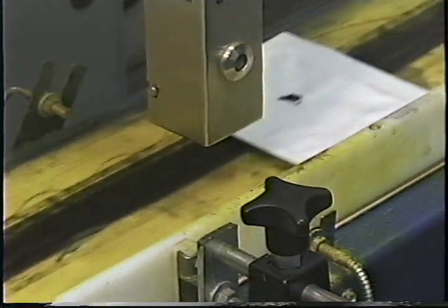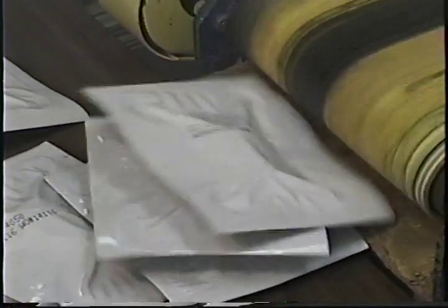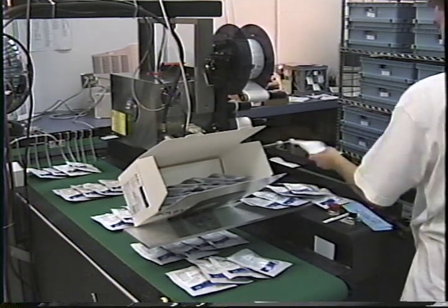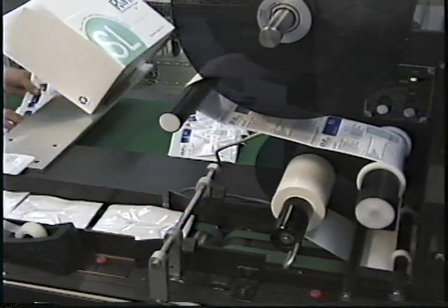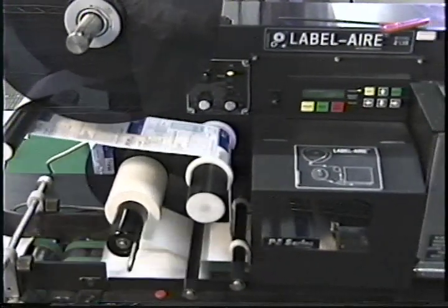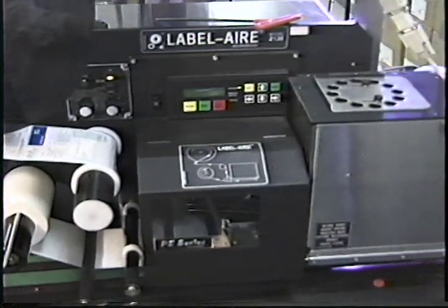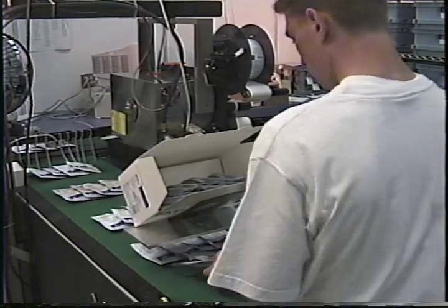The cartridges are sealed in laminated poly. A conveyor moves the foil package along. Each package is given a product ID and a lot and sequence number by inkjet. Then a final quality test is performed on a sample of each lot to determine a calibration code for the user and expiration date.